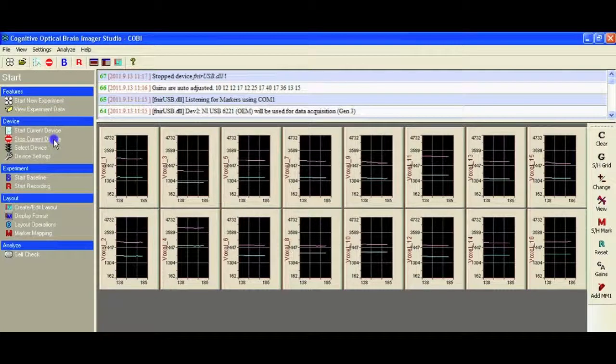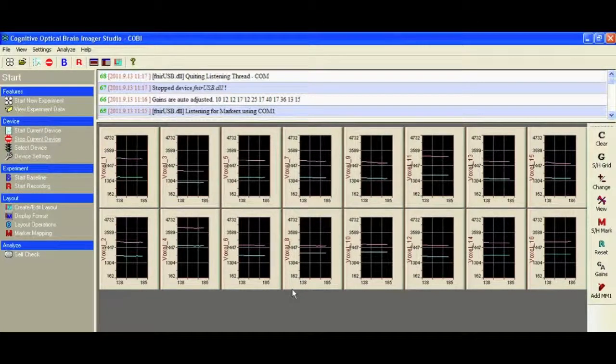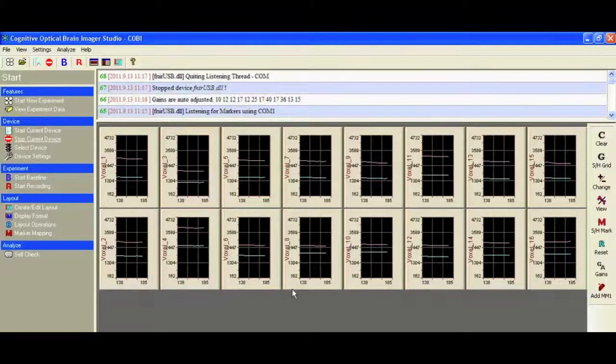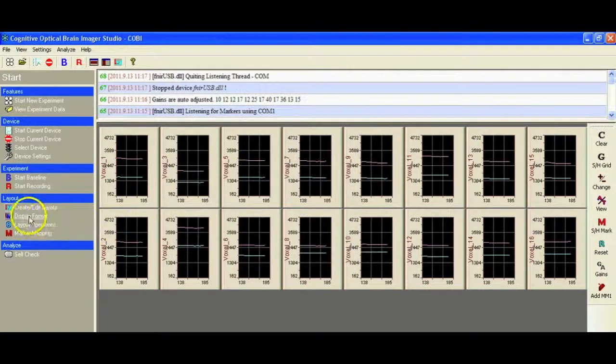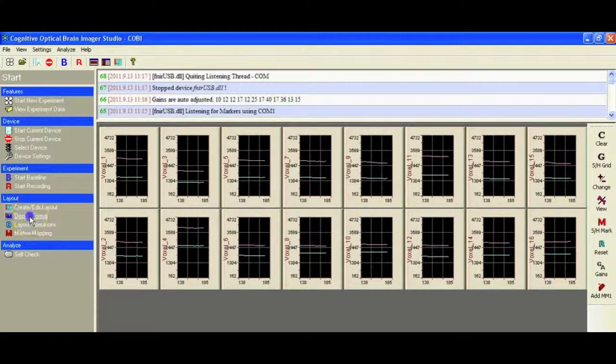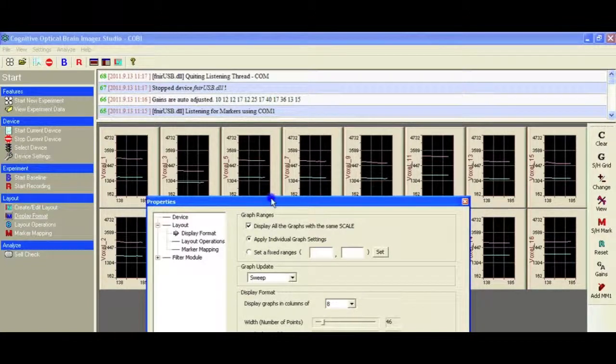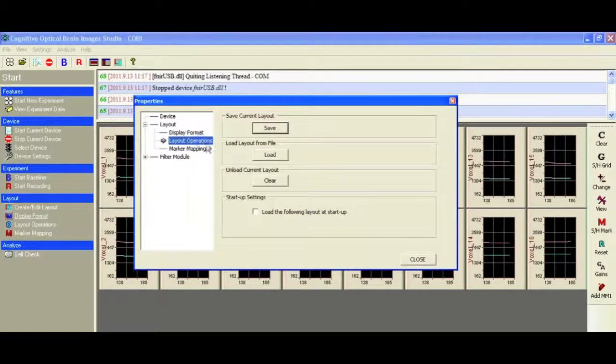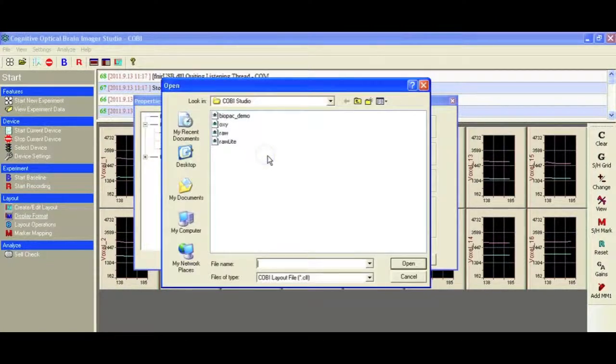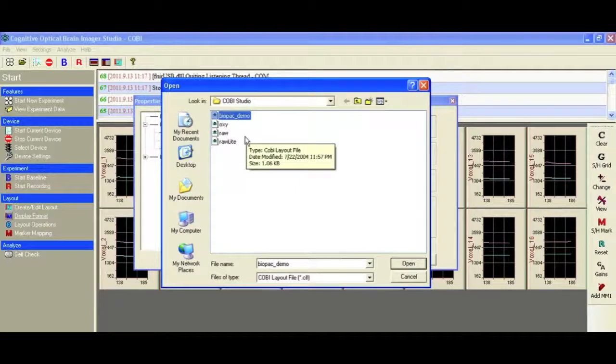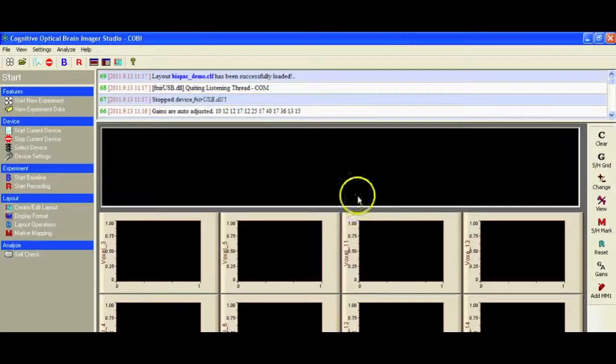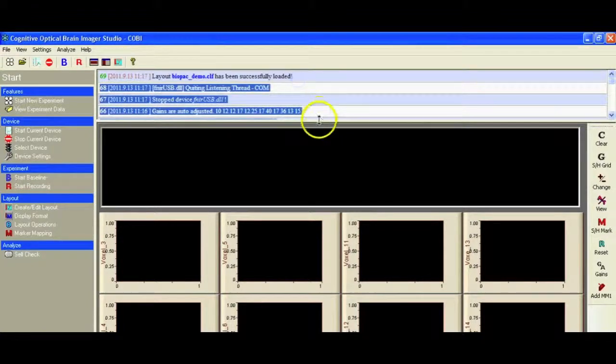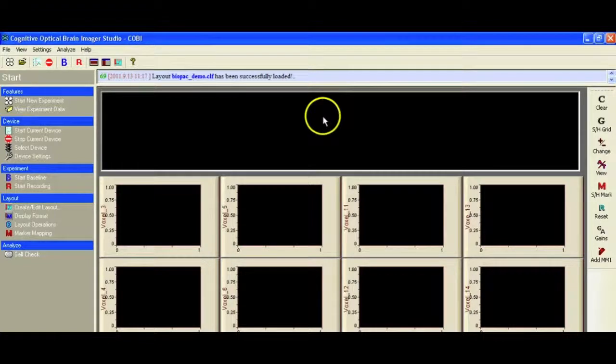We're going to change our layout. This time we're going to set the layout so that we're looking at the oxygenated signals rather than the raw. We actually have a layout that we've already created. So I'm going to go into display format, go into load layout from file. I've got one here that I created earlier. It's called biopack demo, just to make it a little bit easier for this tutorial.